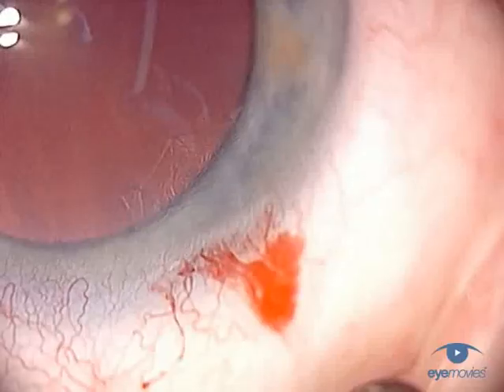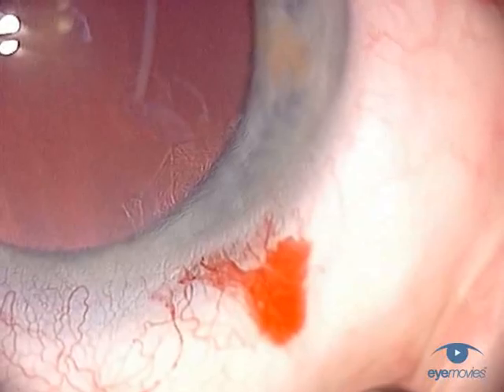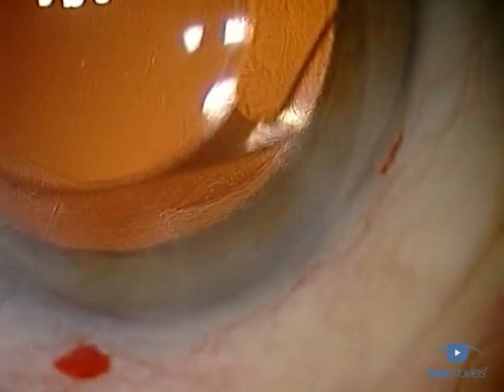A steep entry incision looks like this with a profile that's arrow-shaped, whilst a shallow angled entry gives a curved or smile-shaped edge.